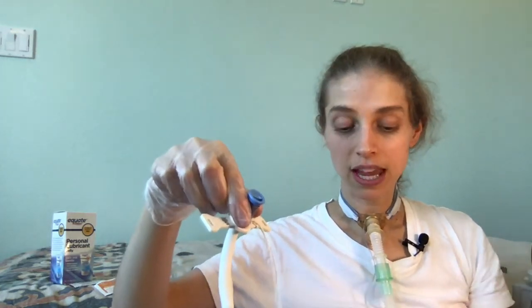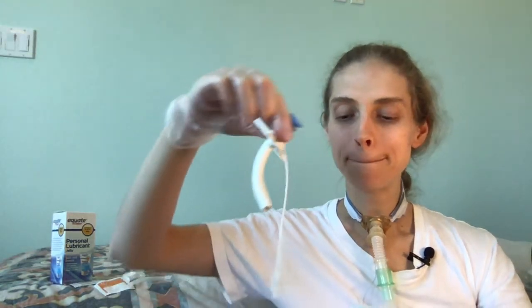Once you have this, you're gonna carefully set this back into this tray. Again, try not to touch anything inside the tray because this is all sterile.